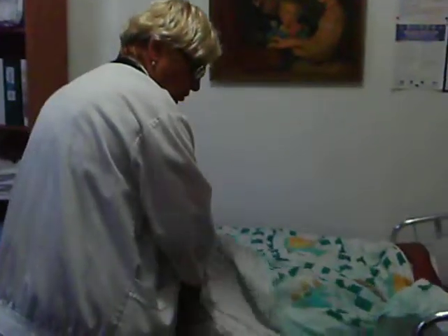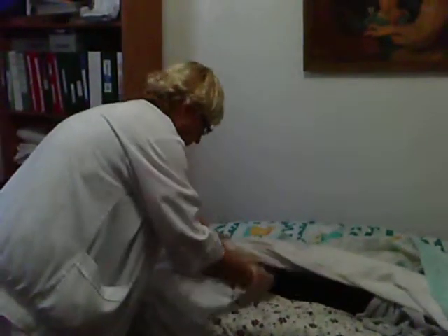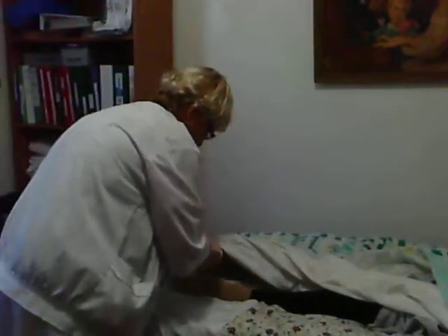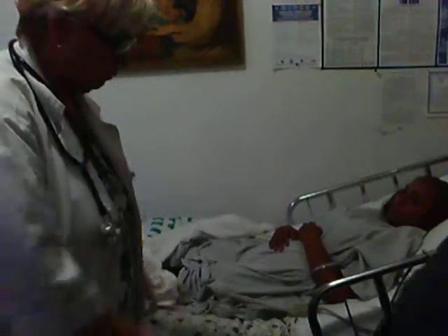You don't have to put them on for the retro — you just can stand in them. But I can put them on for you because you really have nothing under you. The non-slip socks protect you so you do not fall. Okay, I am going to uncover you. I put the privacy. I lower the bed because I need the patient to touch the floor with their feet.